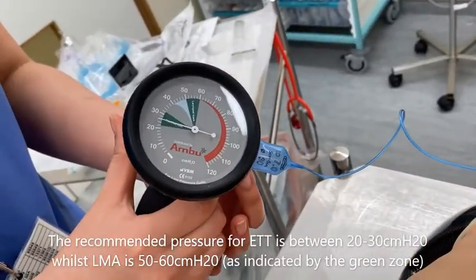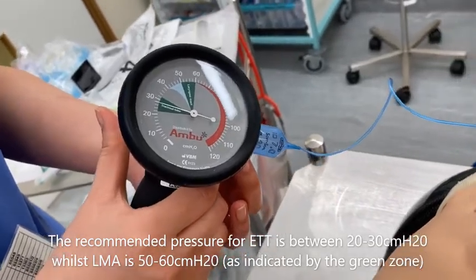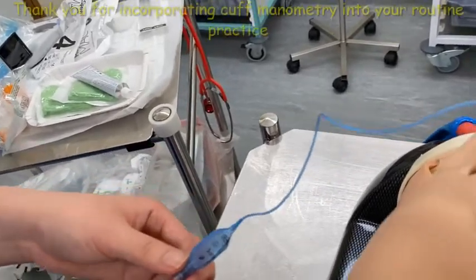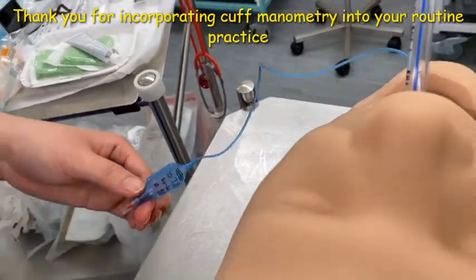The recommended pressure for endotracheal tube is between 20-30 cm of water, as highlighted in green on the manometers. In this particular manometer, you can also find the recommended cuff pressures for LMA.